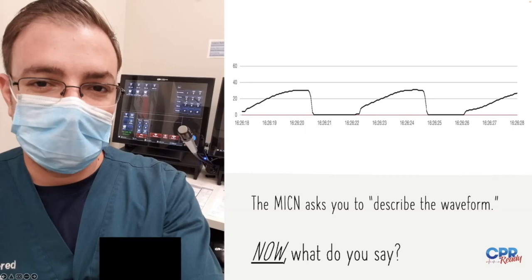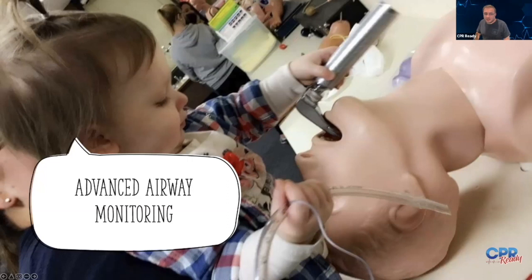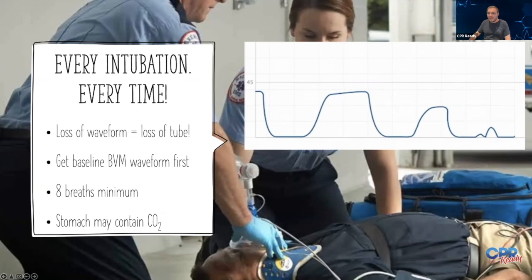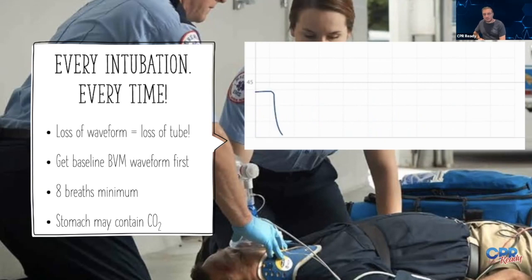So it's not just good or bad or absent or present. So let's talk about some special cases. So we talked about advanced airway monitoring, right? And I just mentioned it again because it is so important. Every intubation, every time, if you have it available to you, and I can't imagine a modern EMS system today that does not have the ability to monitor end-tidal CO2 if they also have the ability to insert advanced airways, they gotta be on some sort of continuous capnography monitoring. You need to be able to see that waveform. It is the gold standard when it comes to advanced airway monitoring.